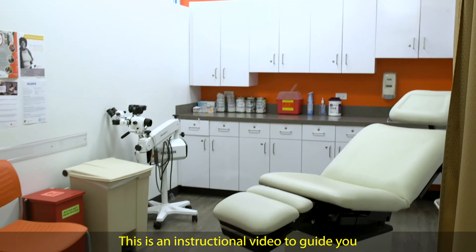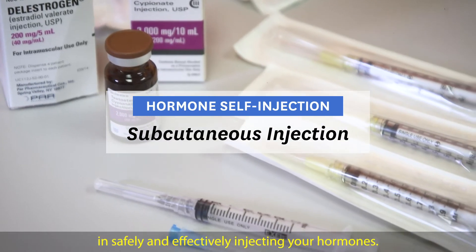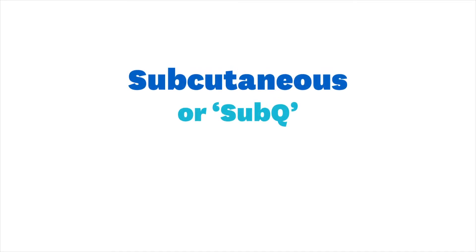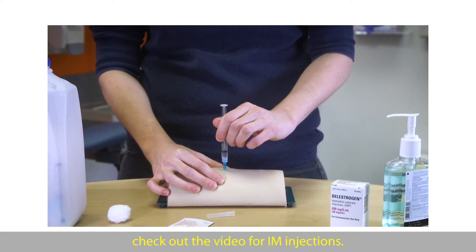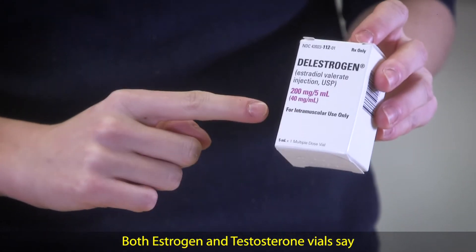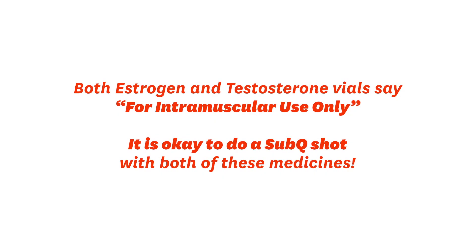This is an instructional video to guide you in safely and effectively injecting your hormones. This video covers how to give yourself a subcutaneous shot. A subcutaneous, or sub-Q, shot goes into the fat and uses a shorter, smaller needle than a shot that goes into the muscle. If you're giving yourself an intramuscular shot, check out the video for IM injections. Both estrogen and testosterone vials say for intramuscular use only, but it is okay to do a sub-Q shot with both of these medicines.